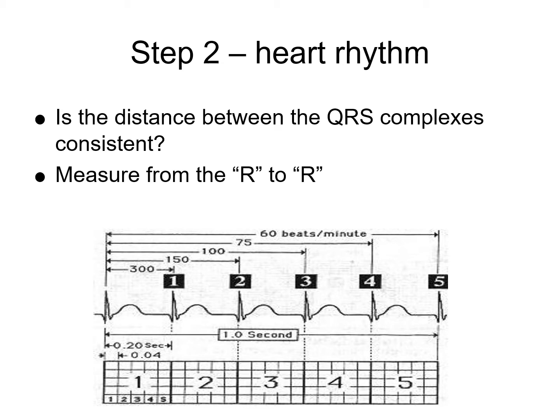distance in between them. Even if you don't have calipers, which they have in the tele room when the tele techs are sitting there watching all these heart rates, you can just take a piece of paper and mark the spike on the edge of the paper, and then the next one, and just march it out and see if that's an equal distance every time. So that's one way of looking at it.